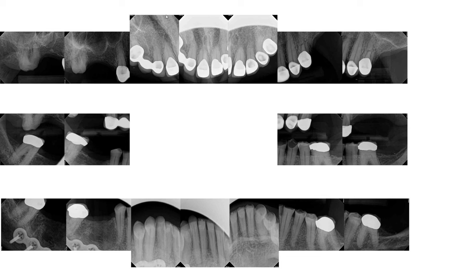Look at these two images — these are examples of rounded cone cut. Here at the school we use a rectangular collimator in order to prevent excessive radiation dose to our patient. But obviously in this example you can visualize that the rectangular collimator was not used.